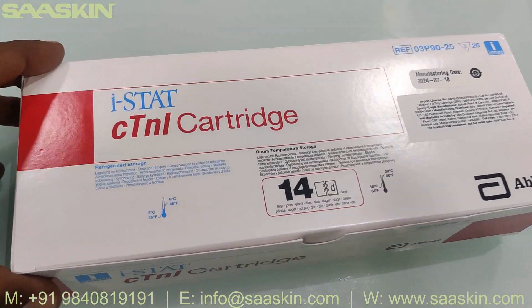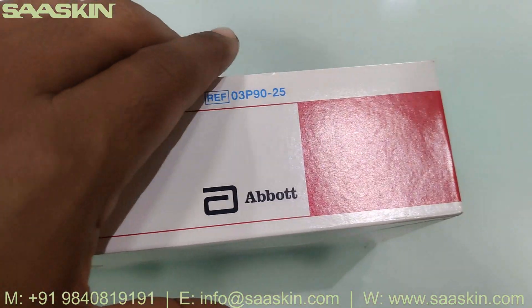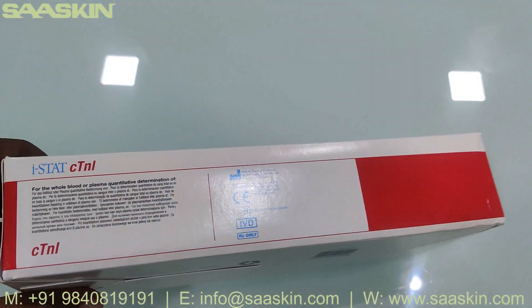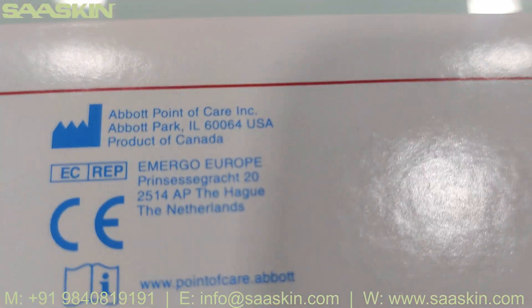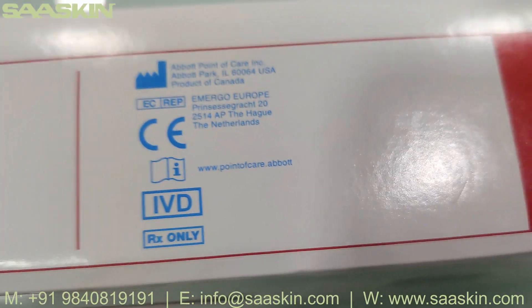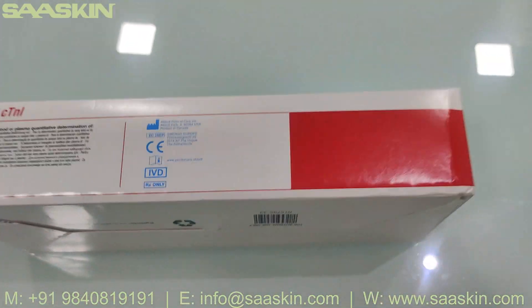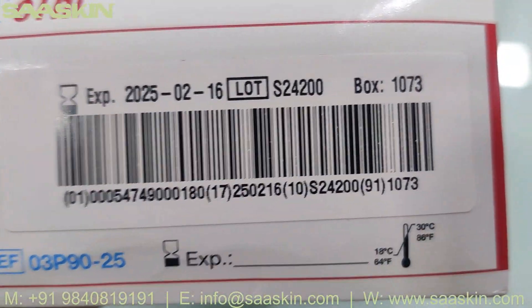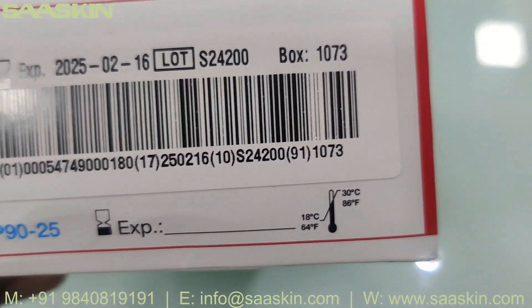Let me show you around the box. You can see it is US CLIA certified. You can see the expiry date, lot number, temperature, and storage conditions all listed here.